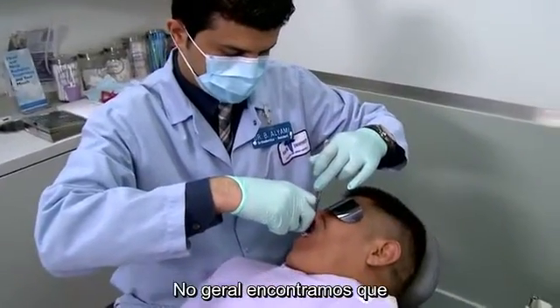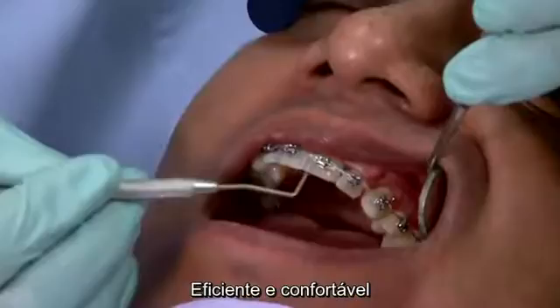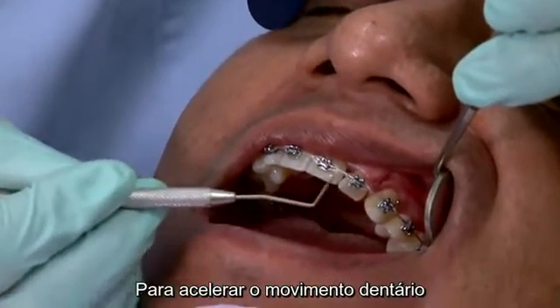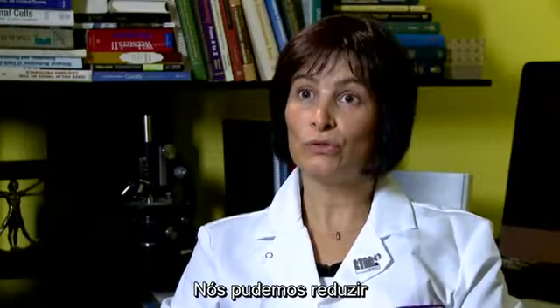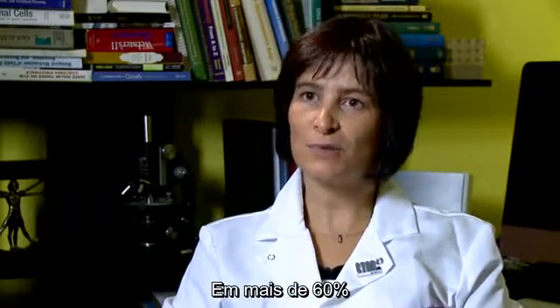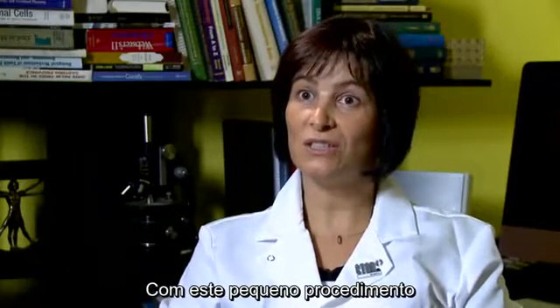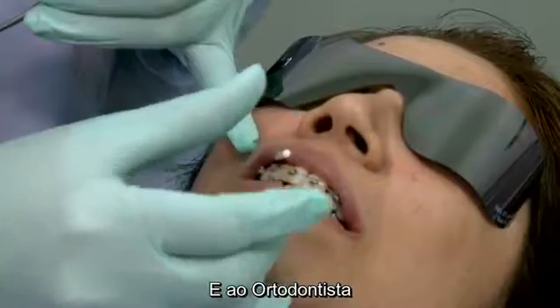So overall, we found that micro-osteoperforations are a safe, efficient, and very comfortable way to accelerate orthodontic tooth movement. We could reduce the duration of orthodontic treatment by more than 60% with this minor procedure, with all the benefits to the patients and the orthodontist.